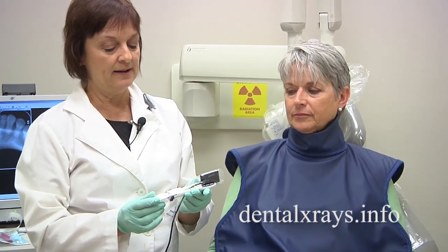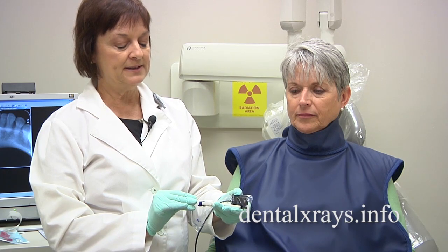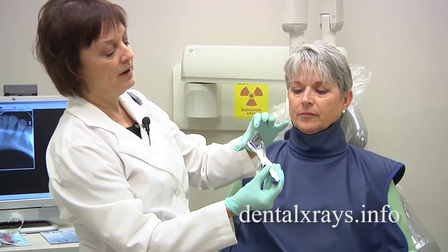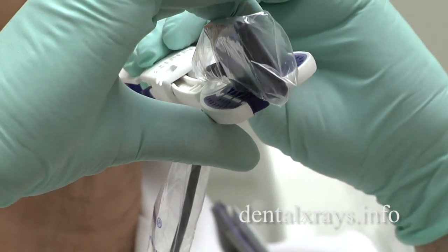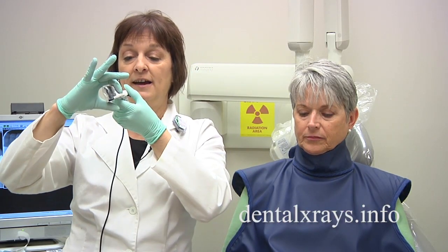Some offices have sensors only, and I'm going to show you how to use the sensor with bisecting angle. It's pretty much similar to using film or PSP plates, but sometimes you run into a few other problems. The sensor is bigger and bulkier, and when placed in the mouth it can hit the roof of the mouth and pull out, which distorts your image — it can even come loose. What you want to do is tip it slightly so the patient can reach the bite block more easily and that won't occur. Pulling like this causes a distorted image by losing the root tips or the bottom edge of the teeth. With bisecting angle it's better to turn everything and increase your tube angle, then have the patient bite hard.